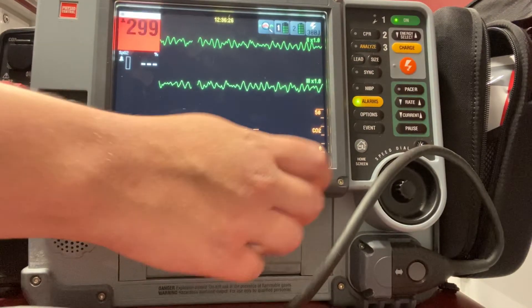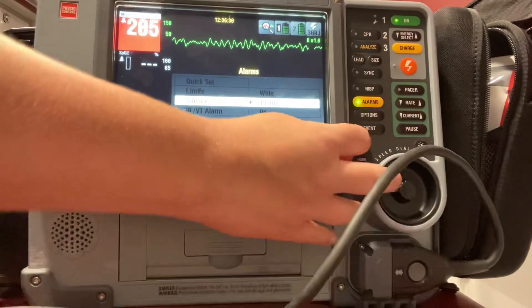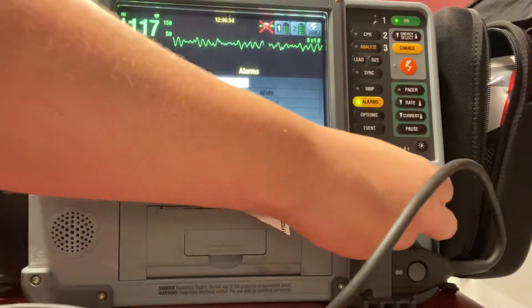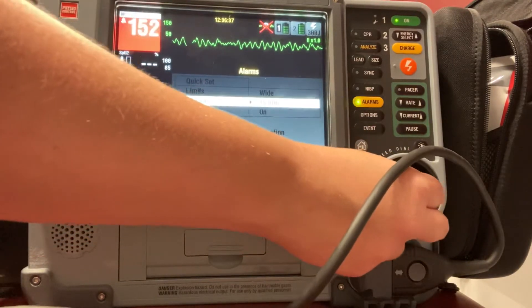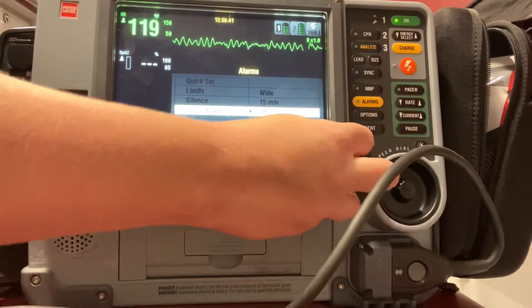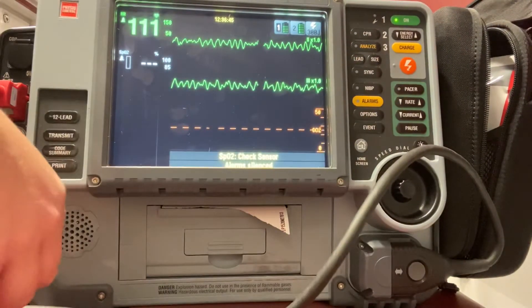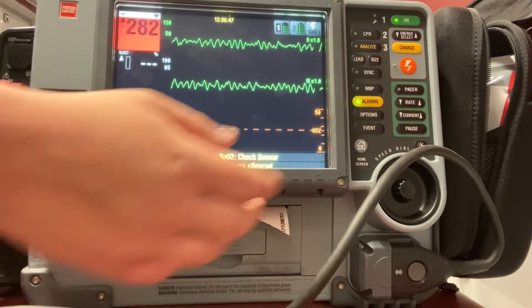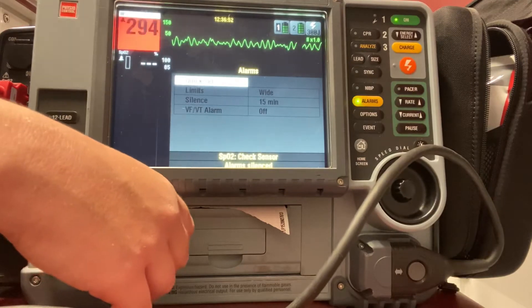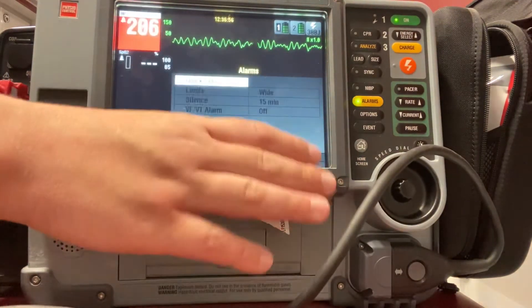I'm going to give it a second for my alarms to go off so I can reset those. Check patient. I have my patient — we're doing our five cycles of CPR, which is going to be two minutes. It's going to keep alarming because it's sensing that the patient is pulseless. I'm going to do my five cycles of CPR — two minutes — and then I want to go ahead and shock again.